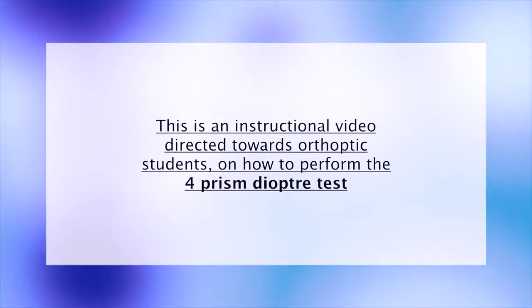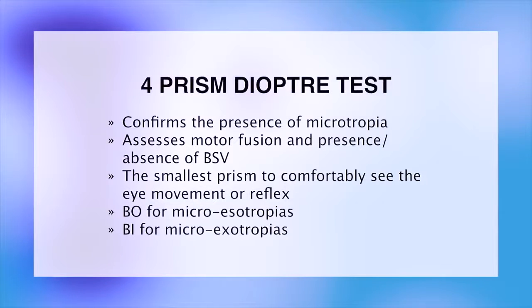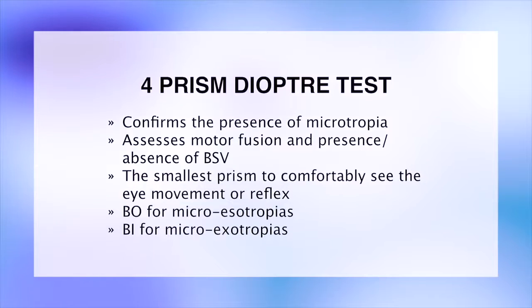This is an instructional video directed towards orthoptic students on how to perform the 4-prism diopter test. A 4-prism diopter test is used to confirm the presence of a suspected microtropia by assessing motor fusion objectively and is determined by the presence or absence of binocular single vision. We use a 4-diopter prism because it is the smallest prism where you can comfortably see the eye movement or reflex. A base-out prism is used for microesotropias and a base-in for microexotropias.